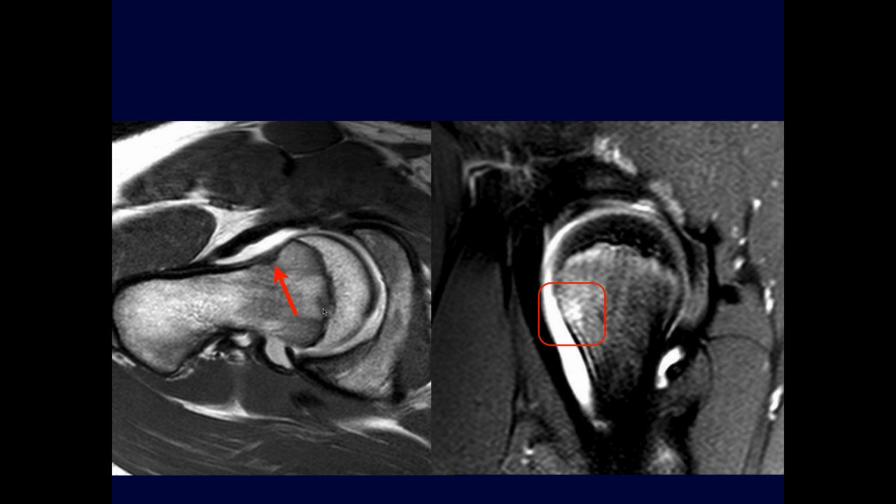I certainly agree with you, and I've seen that. But the thing is, it's painful. And this one was painful. That's why they're getting the study. Yeah, this one was painful. And that's edema there, isn't it? It is. It's edema in the bone, which is a pretty reliable indicator of symptoms.